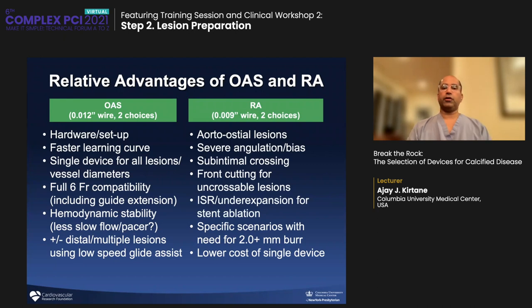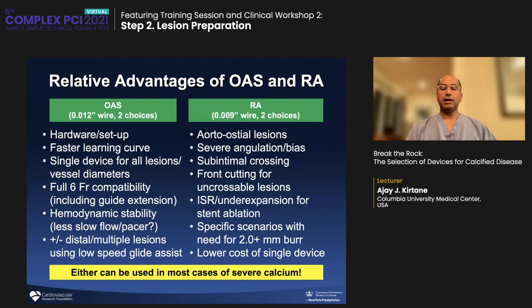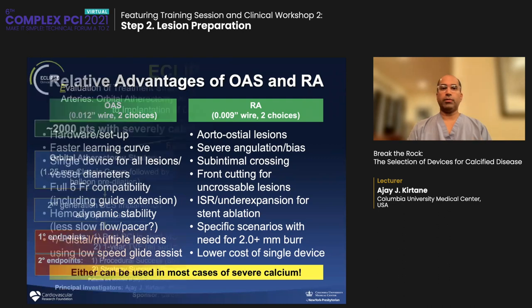And then there are other scenarios as well where you need to have larger and larger burrs. So overall, my take on this is not to say that one is better than the other. It's that either can be used in most cases of severe calcification. And the idea is to become facile at both so as to know when one is advantageous versus the other, versus other technologies such as NC balloons alone, balloons like the OPN balloon, and then lithotripsy as well.